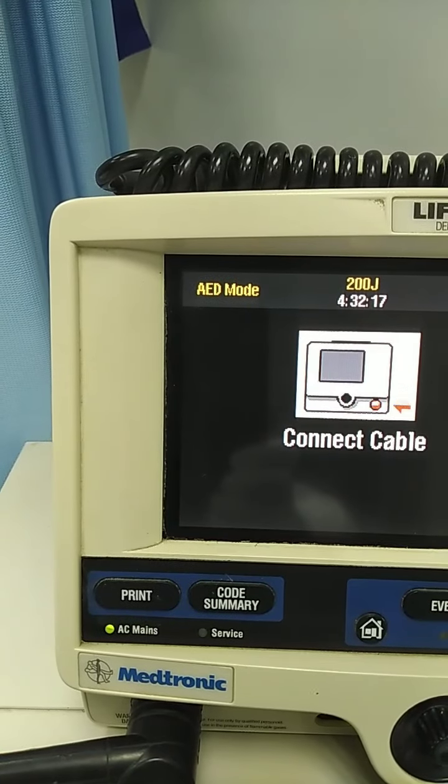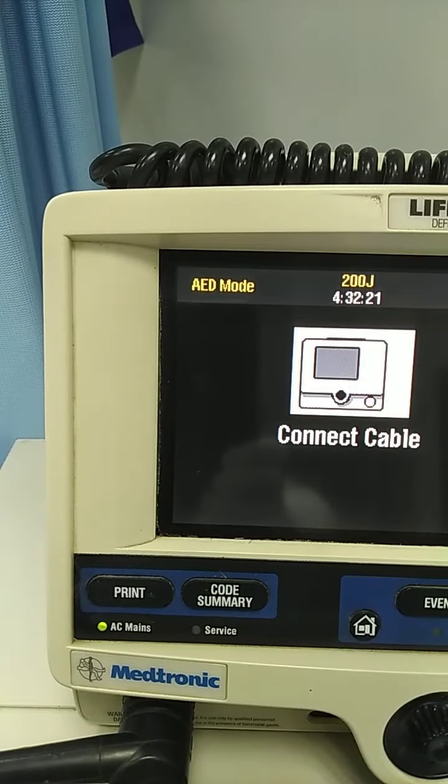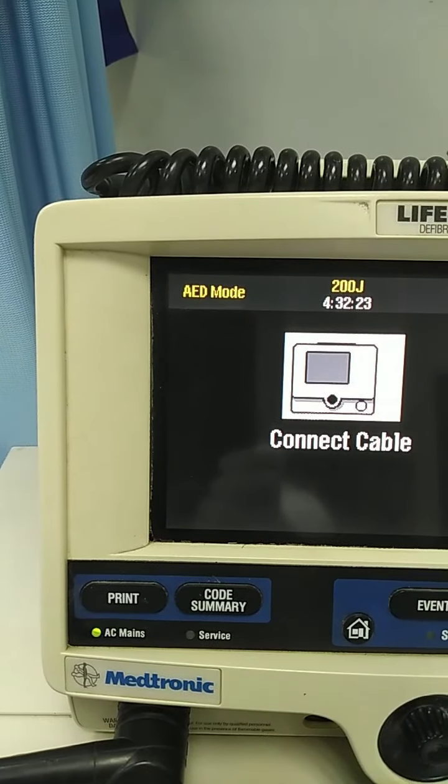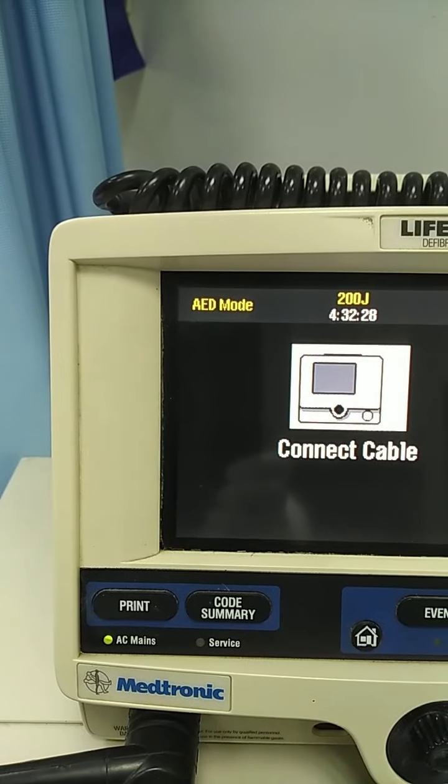Okay, this is the end of our topic. I hope that this lecture helped you to answer some of your questions on how to use the LifePak machine.